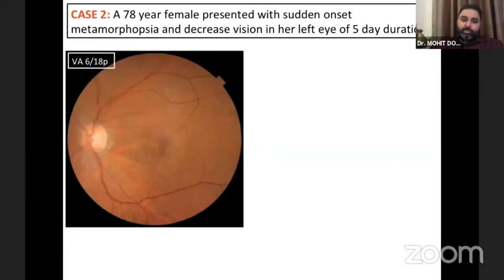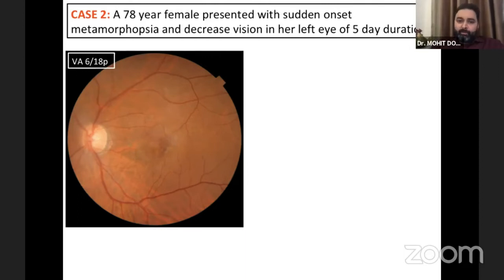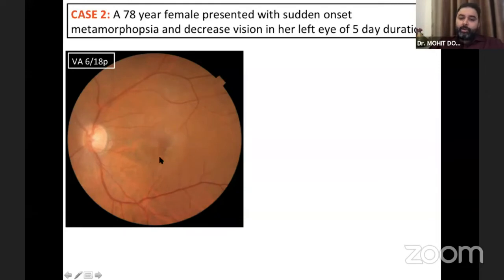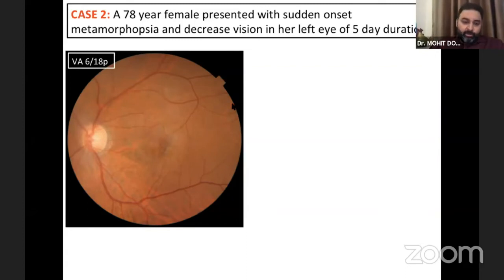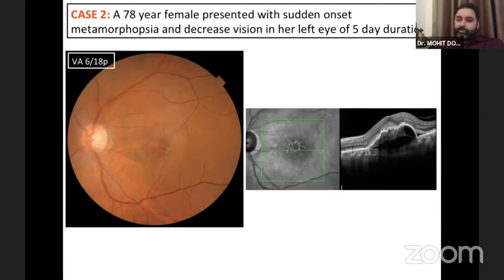Moving quickly to Case 2, which is in stark contrast to the first. This is a considerably elderly female, 78 years old, who presented with sudden onset metamorphopsia and decreased vision in her left eye. She was very categorical about the five-day history — an educated, smart lady with a visual acuity of 6/18. You can see something which, on cursory exam, might look like what was seen in the right eye of the previous patient — vessels going into an area of retinal thickening.